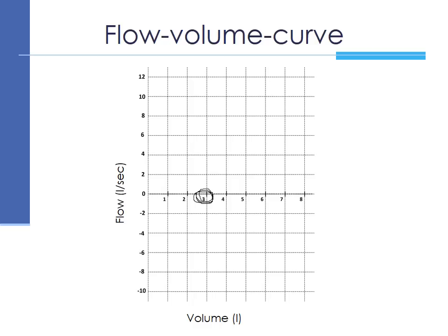After this, the patient was instructed to inhale deeply. So this is the deep inhalation, maximal inhalation. This is followed by forceful expiration. Remember, this continues until the beep. The patient hears the beep, and then this is followed by the final inhalation.